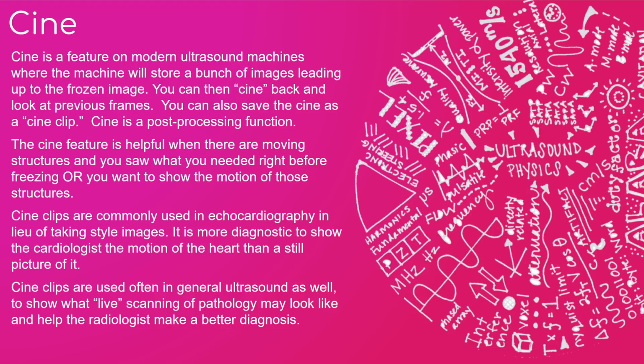Another feature on our ultrasound machine is called the cine. The cine is very helpful, especially when you have a patient that's moving or you need to capture some live imaging of what you're seeing. So for general ultrasound, quite often you'll be scanning and then you'll see something and you'll freeze, and then you can cine back, go back a couple frames and grab that picture of what you just saw. So the cine is the machine temporarily saving like 120 frames, so you can scroll back a couple frames and find what you were looking for.